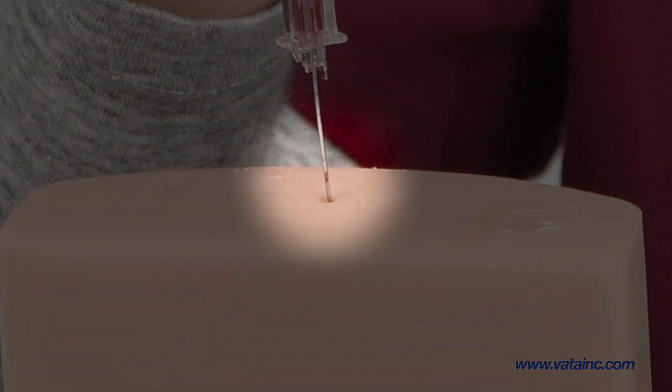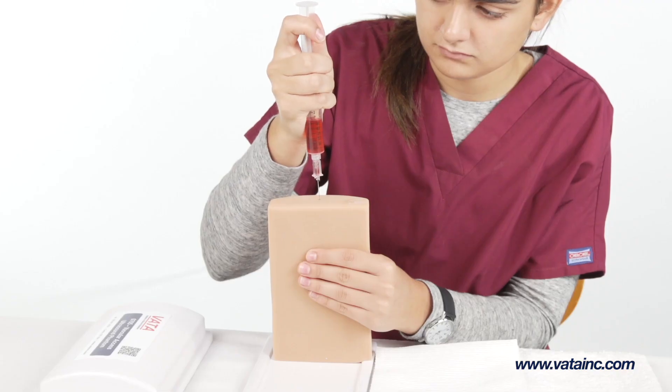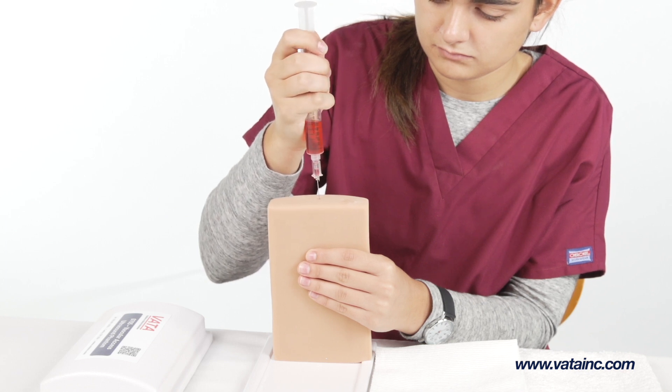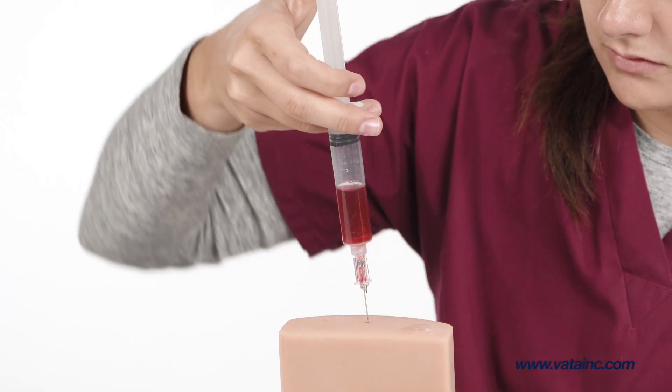Insert the needle into the dimple of the vessel you wish to fill. The mark should be just outside the flesh-colored phantom material for proper placement — this will ensure the needle tip is properly placed in the vessel. To remove any trapped air, keeping the needle and syringe above the phantom, draw back on the plunger into the unused portion of the syringe.